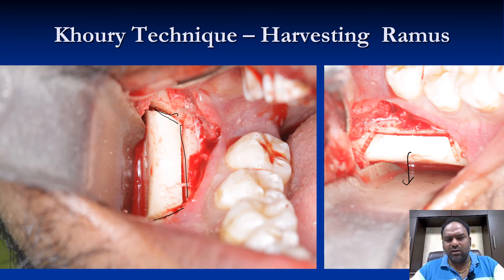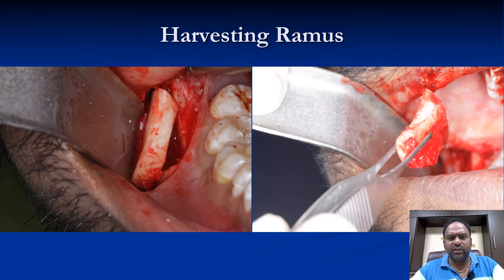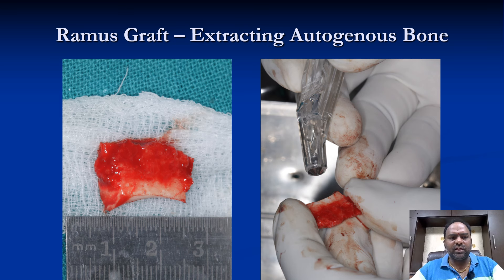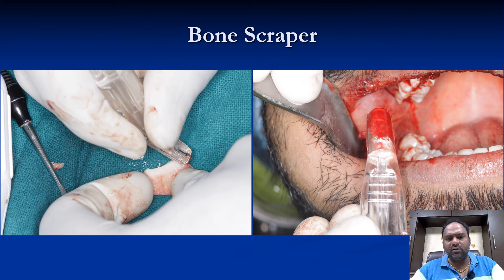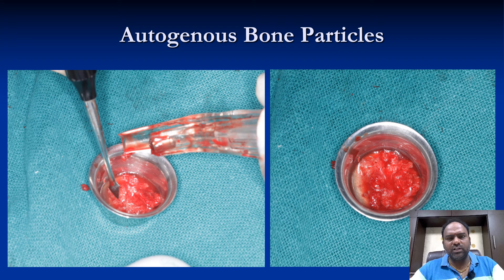We harvested the ramus graft — this is how the ramus bone looks. Then came the most annoying job, which I don't particularly like: scraping the cancellous bone. Once the cancellous bone was scraped, these are the autogenous bone particles, which we kept in IPRF prepared from the patient's blood.